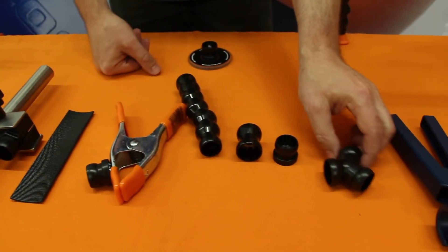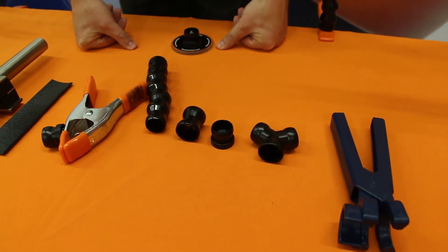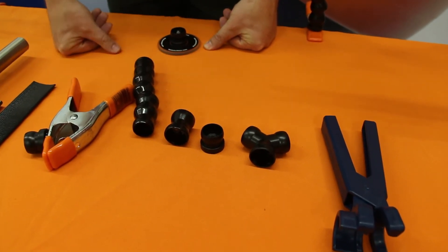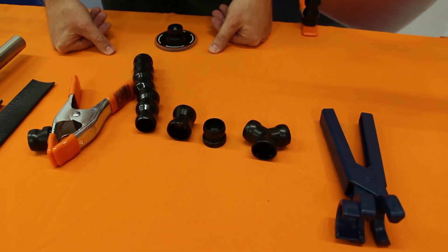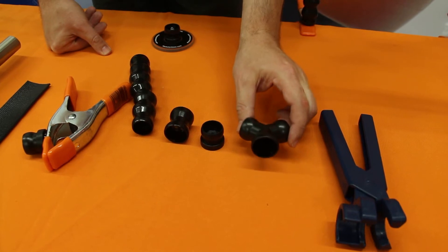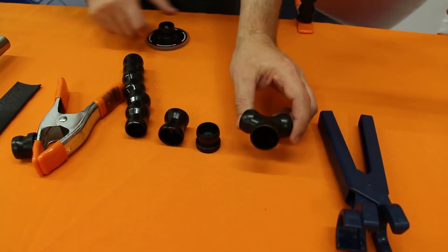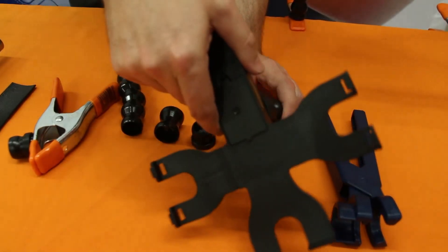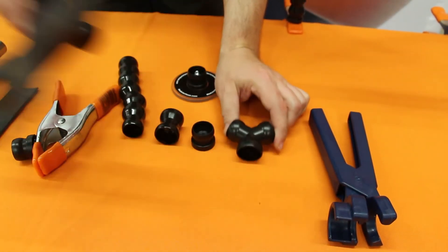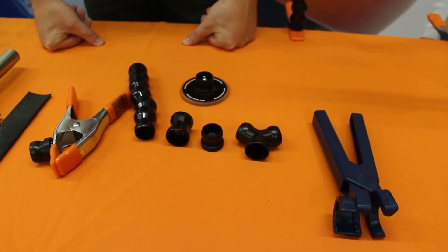Another item is this Y fitting. In some applications, like supporting an iPad or tablet device, we use a two-arm system to provide extra strength and rigidity. This piece is what you use to join two lock line arms together, and from there you attach your tablet holder, plate, or whatever other component you want. It gives you the ability to join two arms together for extra strength.